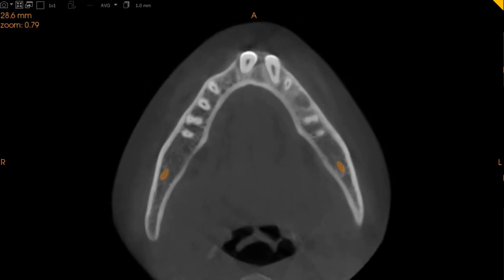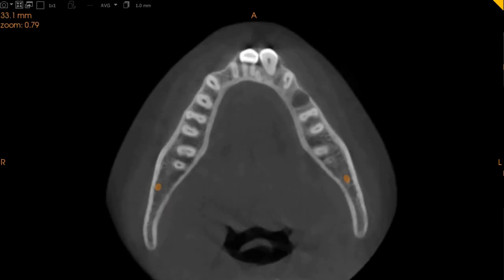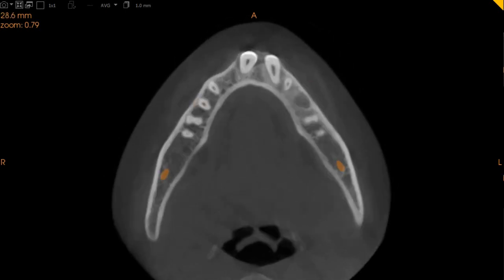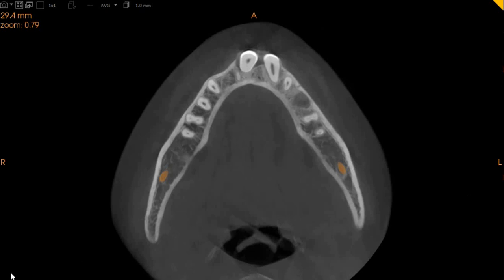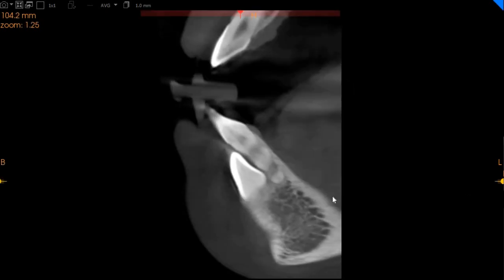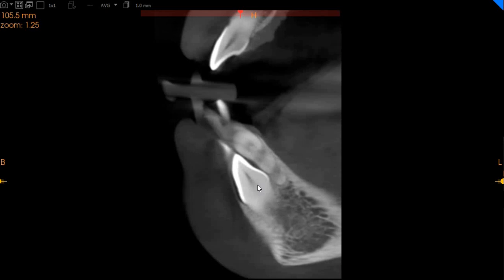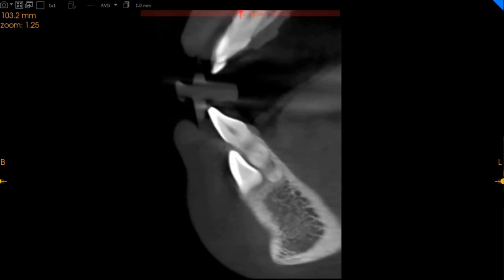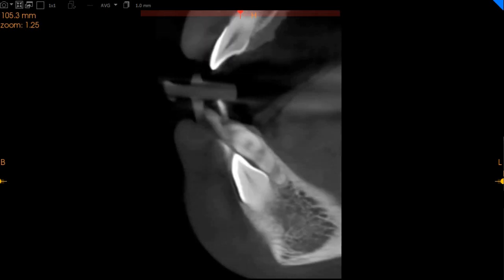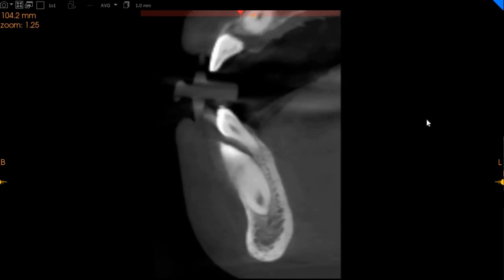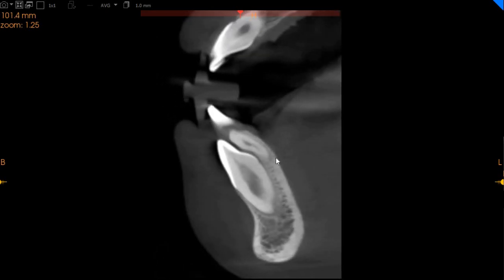Both the apices of the canines have been closed, and you can see that the crowns have perforated the buccal cortical plate. On the trans-axial view, the canines are anterior to the lateral incisors and the central incisors on the lower right side. The lower left canine, which is mesioangular, is also anterior to the lateral incisor on the left hand side.